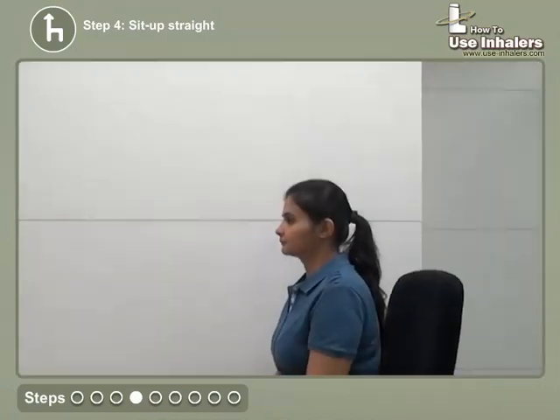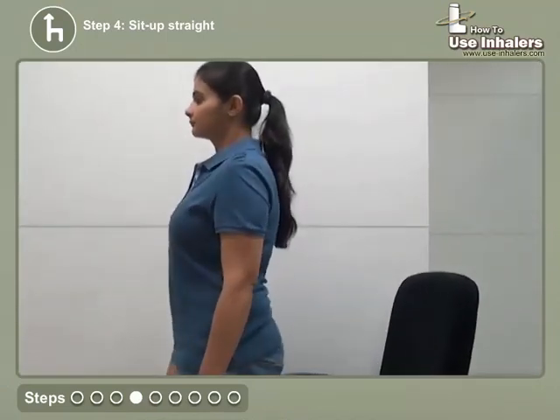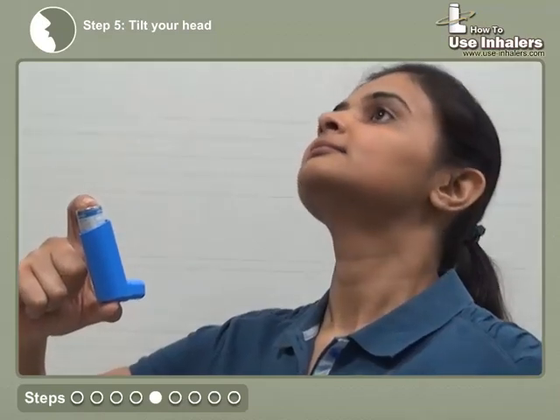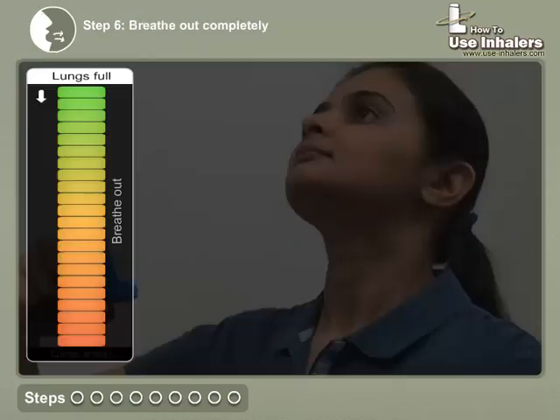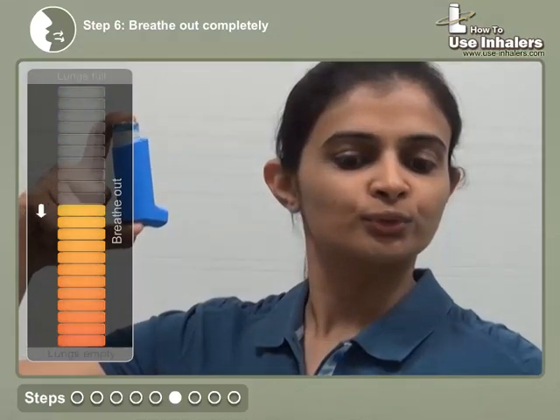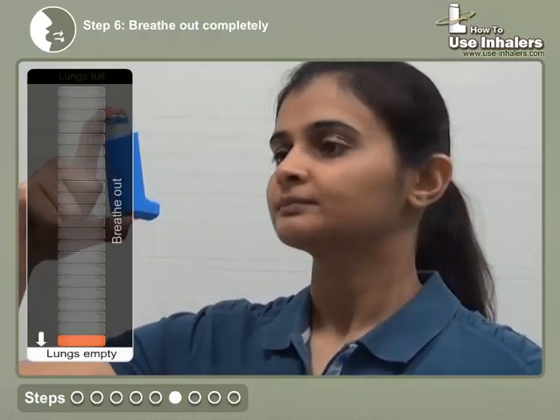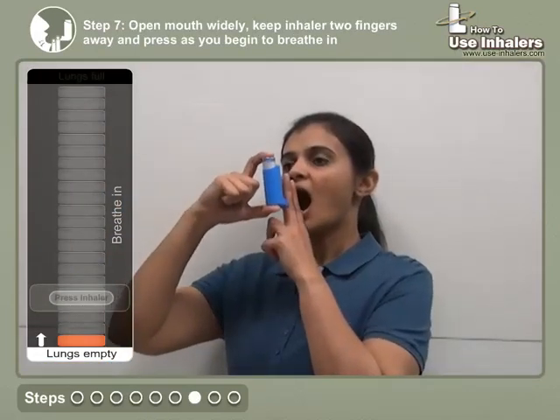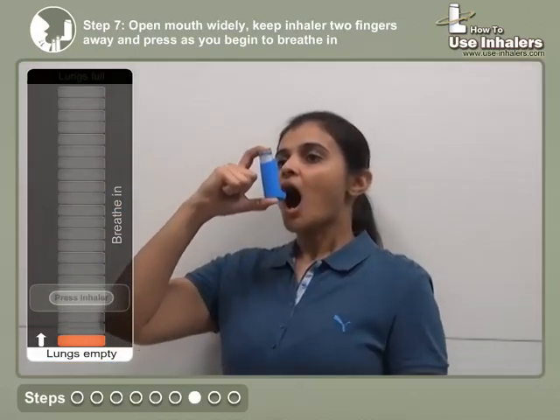Sit up straight or stand up. Tilt your head back slightly. Before starting to inhale, breathe out completely away from the inhaler. Open your mouth, and place the inhaler 2 finger widths away from your mouth.